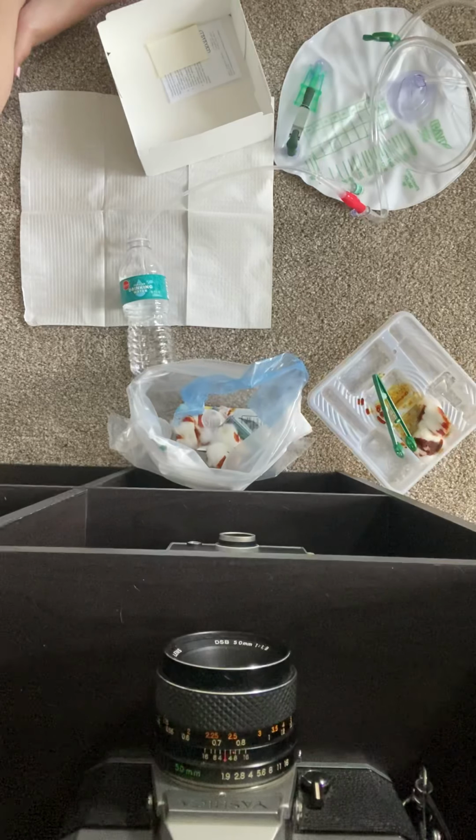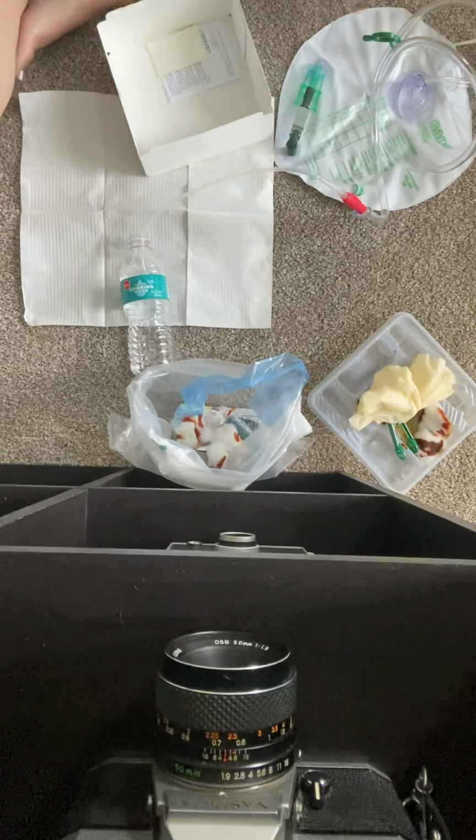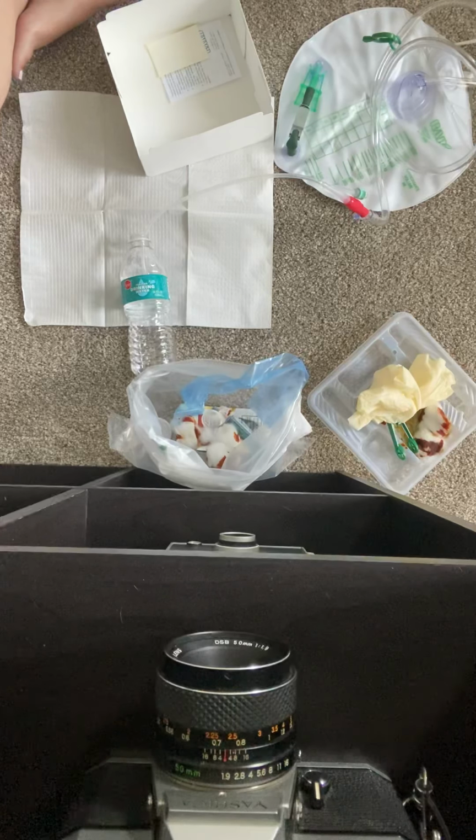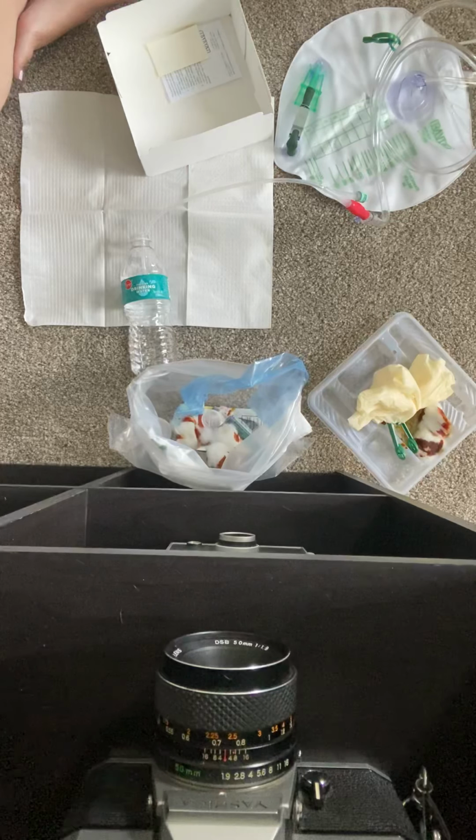And then do my hand hygiene, and then lower my patient's bed if I had it raised and all that good stuff. And then I had already said that I was gonna secure it, so obviously, securing. And then I wanna make sure that my peri area is clean. A lot of times I feel like the iodine, or the betadine, sorry, is okay to stay on there. But you do wanna make sure it's dry, because moisture can build up in there and you don't want to have that. So make sure that your peri area is clean and dry.